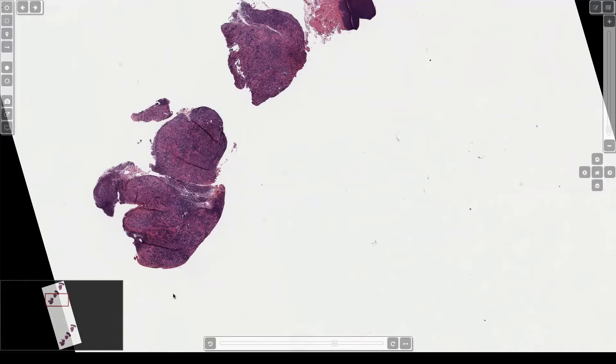A nodule of something that looks like the whole thing's been shelled out with nothing attached — almost always, that's a subcutaneous nodule. If you see little ratty strands of pink dense collagen around it, that's almost always a subcutaneous nodule from the hand or the foot, because hand surgeons go in there and just try to pluck it out without damaging anything else. Things on the tendon sheath can push up into the subcutis on acral surfaces and they'll just pluck it out.